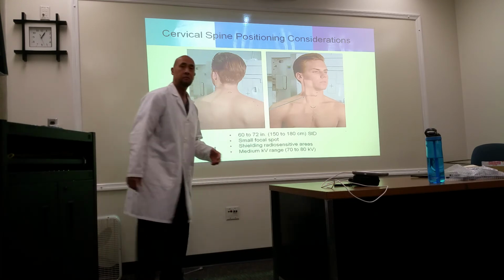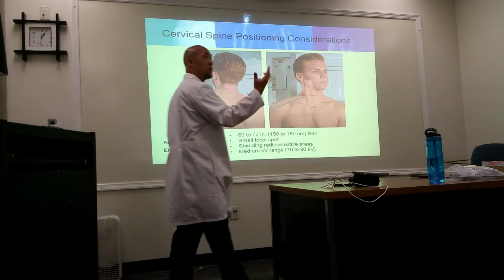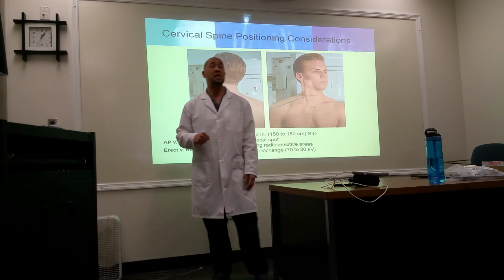But on APs and odontoids, we shoot them at 40. Yes, you can do them at 40. So Nick just says, well, odontoid and AP, we do it at 40. Yes.